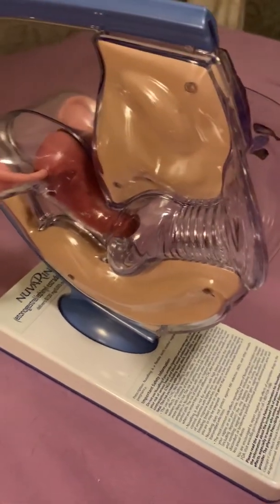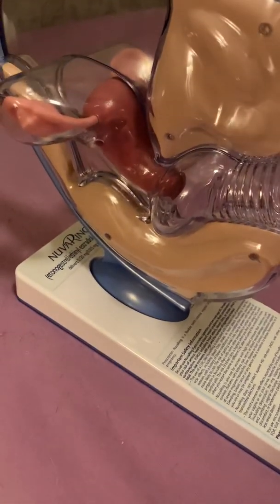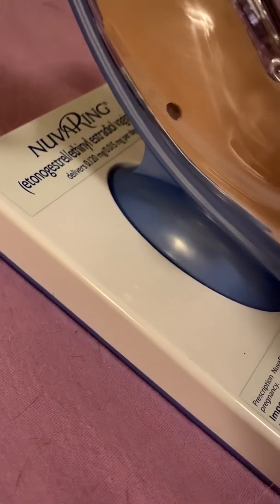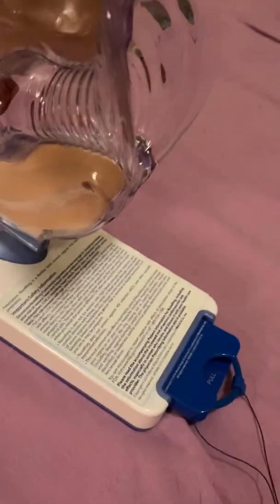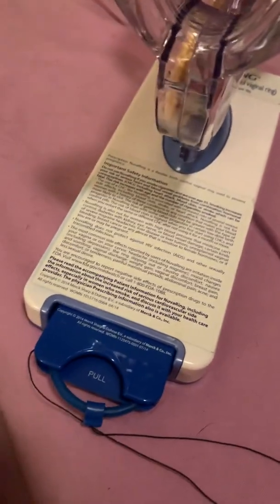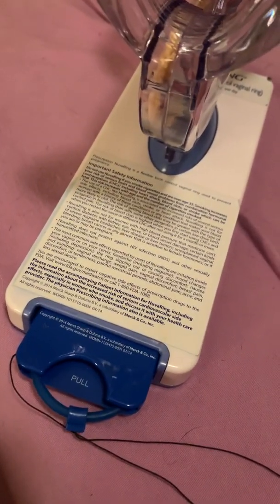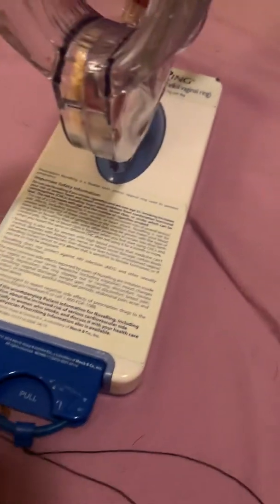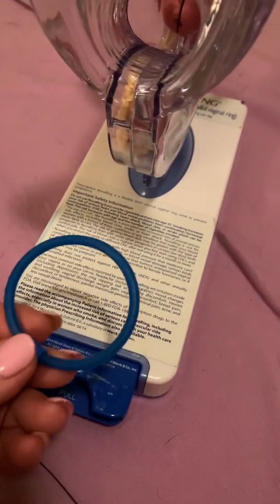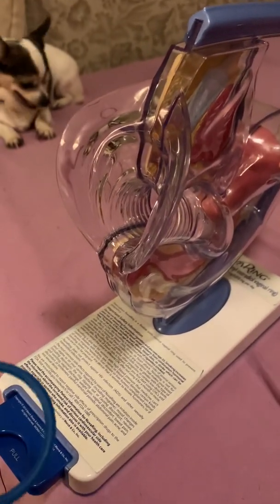This is a model — a cross section of the female genitalia — and it is a model used to demonstrate to women in a doctor's office how to use a NuvaRing. A NuvaRing is a hormonally based insert into the female, and this application has to be done monthly.